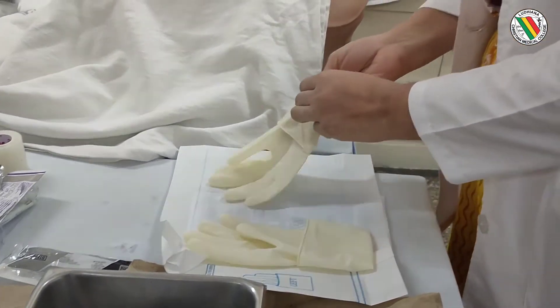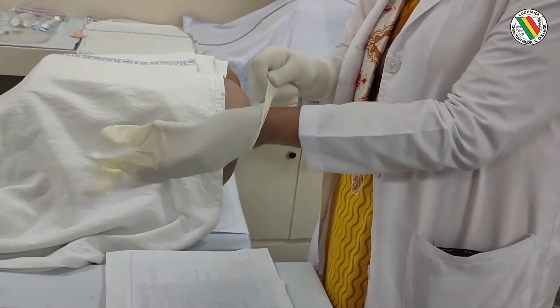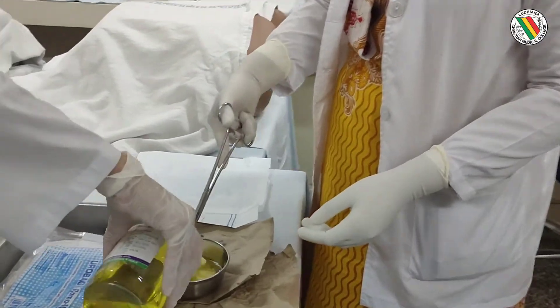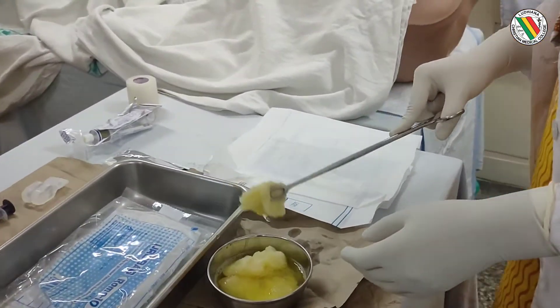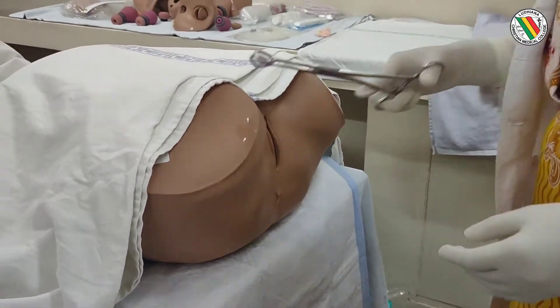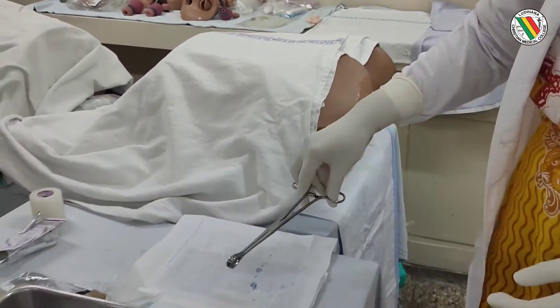First we need to wear a sterile pair of gloves, then we need to take the sponge holder with Savlon or Betadine and clean the perineum and vulva with a downward stroke from anterior to posterior.